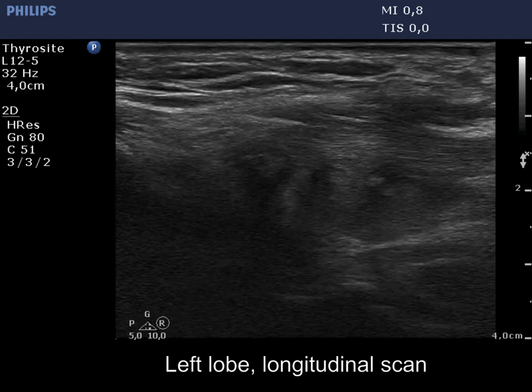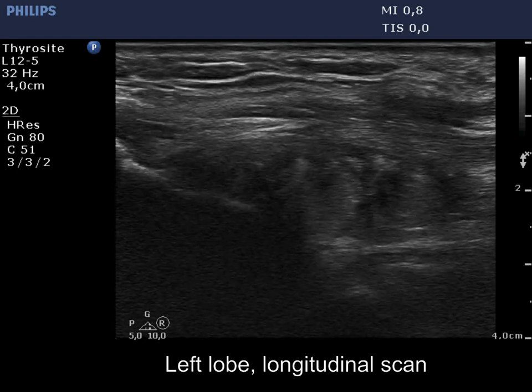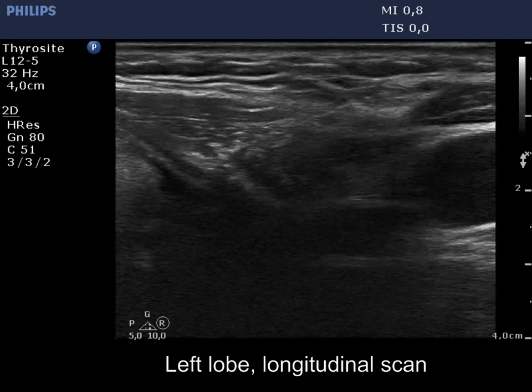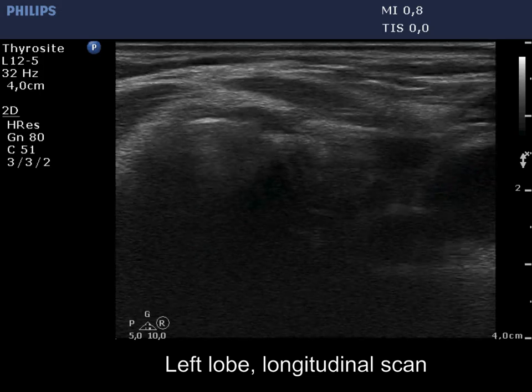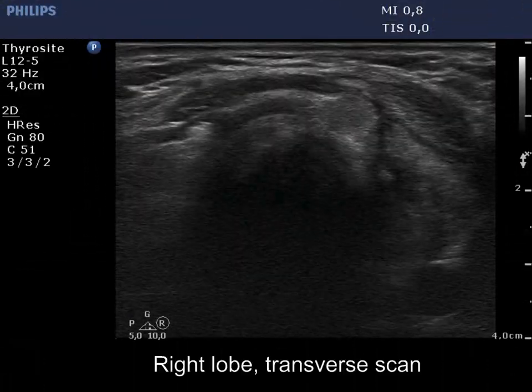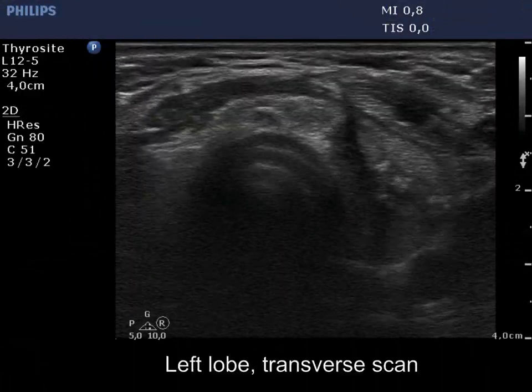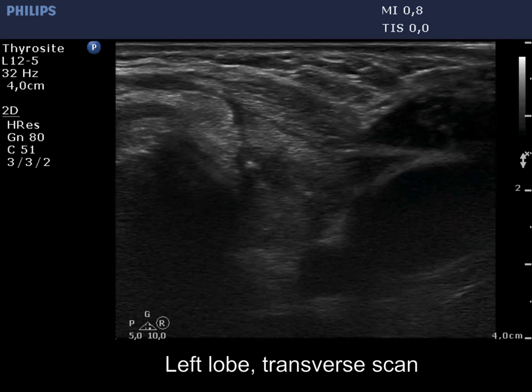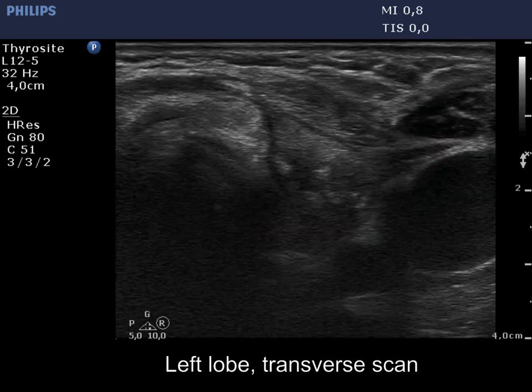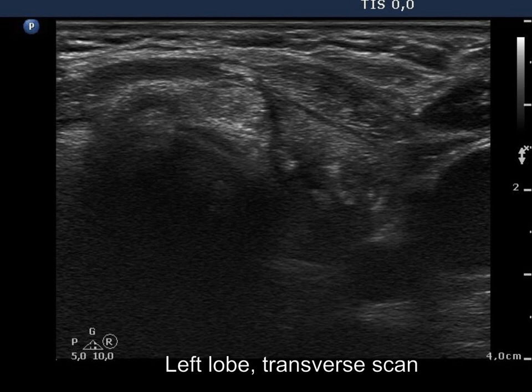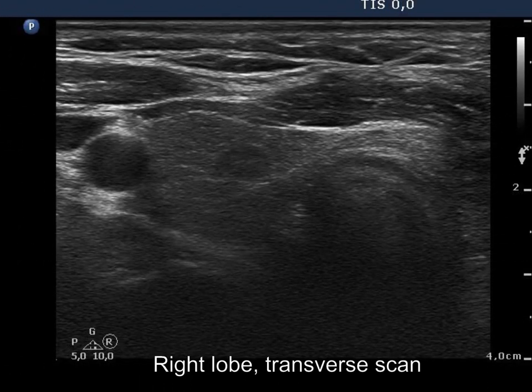In contrast with the normal thyroid, the borders of this regenerative tissue are equivocal. It is worth comparing the well-demarcated, uninfluenced right lobe with the operated left thyroid. The mass of regenerative tissue is larger than the intact right thyroid.